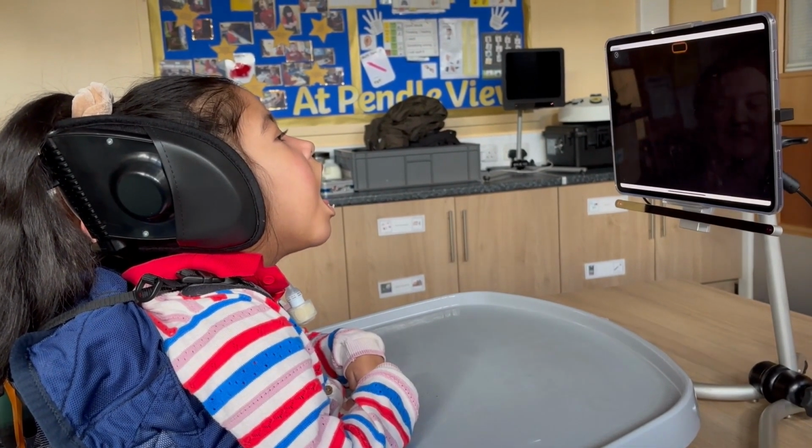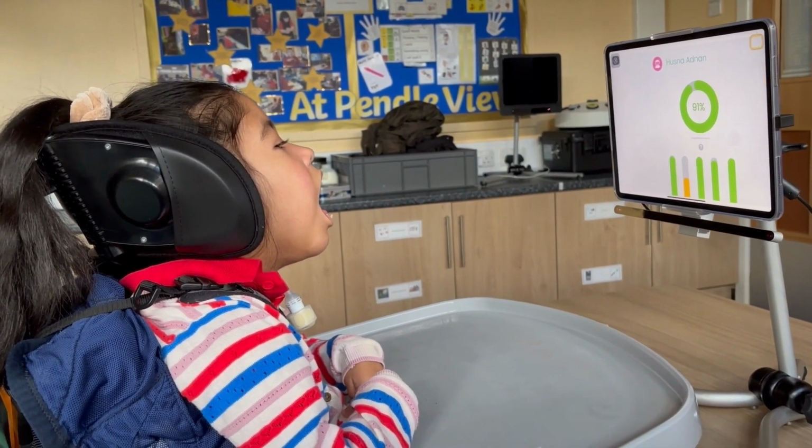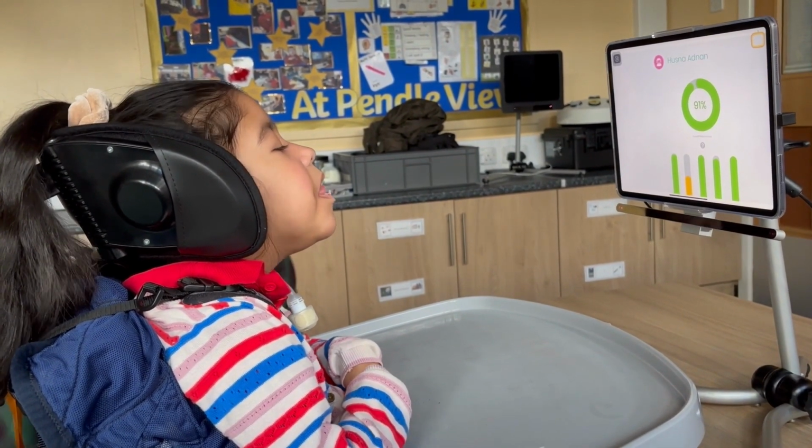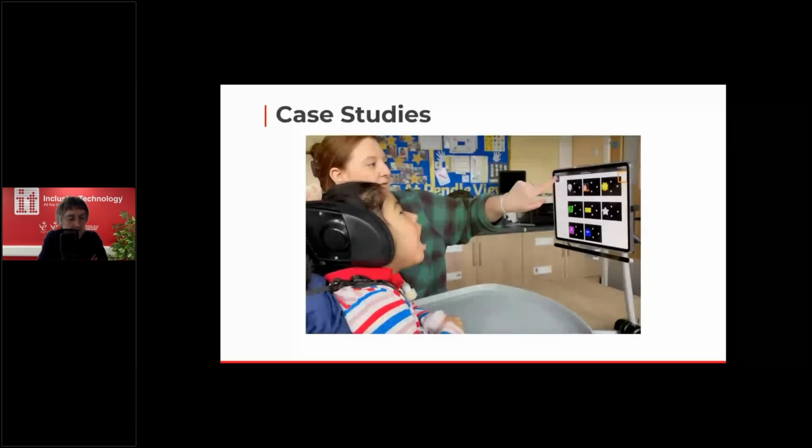Oh my goodness! She got an even greater score on the one more tricky activity, each progressively better than the last. Wow. The final word from the teachers about Husna was we are very much at the start of Husna's eye tracking journey, but are very excited to see where she will go. And as you saw from the video, I'm sure she'll benefit greatly with Eyetuitive.